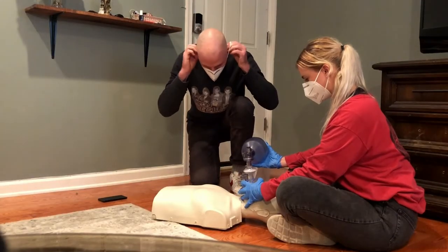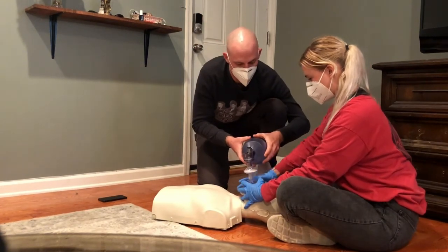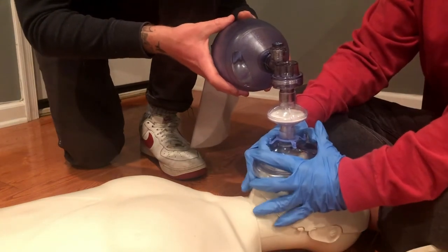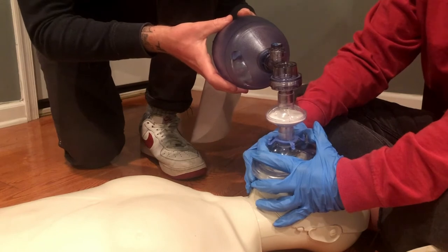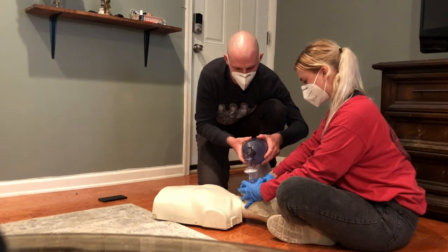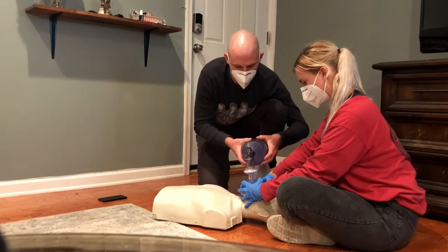Once the first person has achieved a proper seal, the second responder can squeeze the bag. This frees the first person to use both hands to hold the mask in place and maintain the seal. You want to squeeze the bag once every six seconds, and each squeeze should last about one second, providing just enough air to see the chest rise.